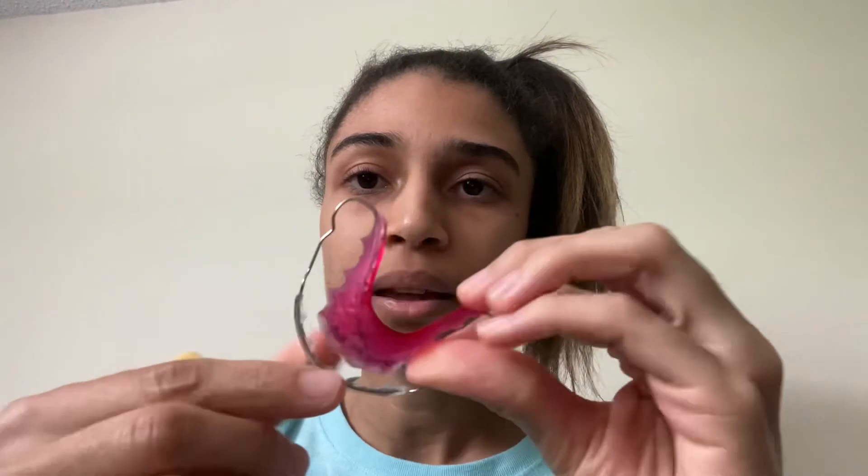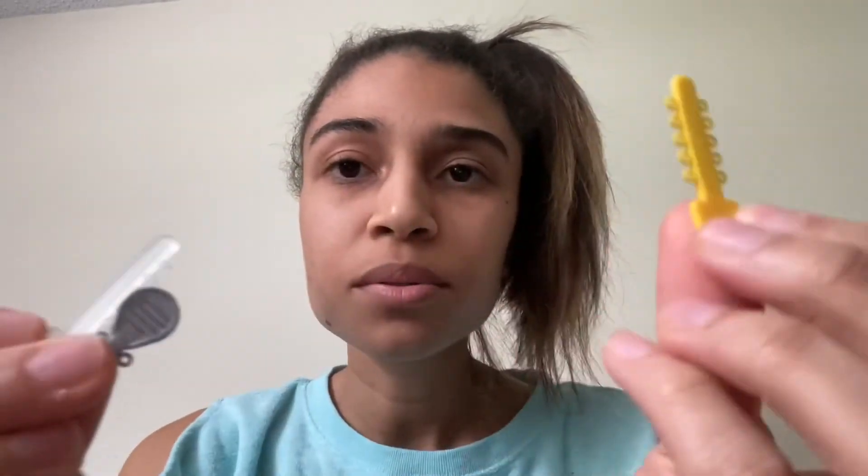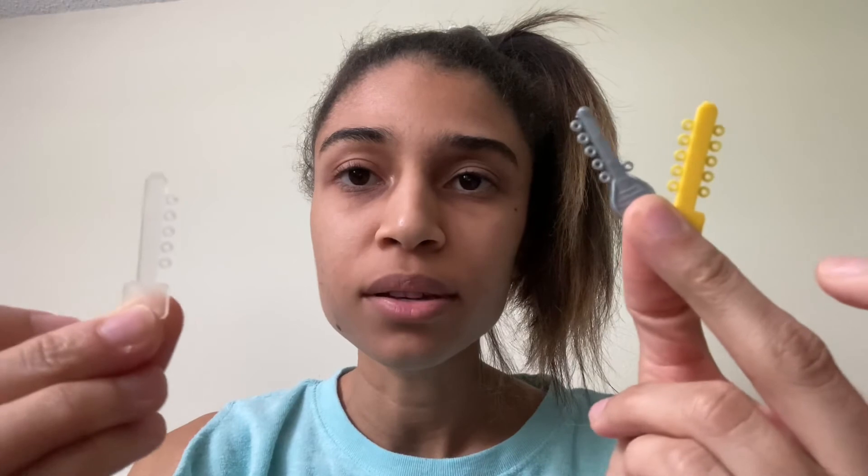I have two retainer Hawleys. This is an upper and this is the lower Hawley. The difference is obviously one's for the top, one's for the bottom. Another big difference is the upper has a palate and the lower does not. I also have elastomeric ties — as an orthodontic assistant you will probably use these every single day with every single patient, unless they're Invisalign.